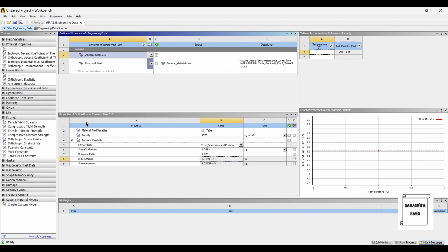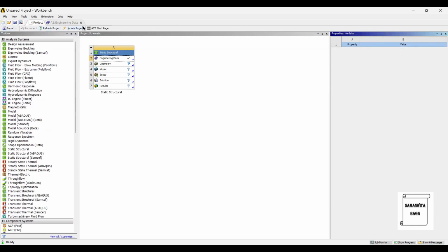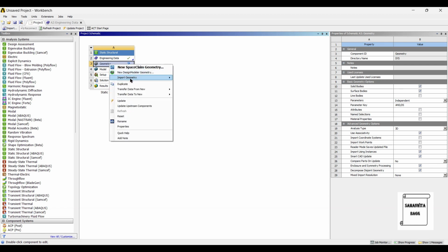Apart from these, I am also going to give the value of compressive yield strength. The value is 310 megapascal, so it is 310 E6 pascal. Next, I'll go to project and update project. Now I'll go to geometry and right click. Since I've already made the geometry, I'll import it.